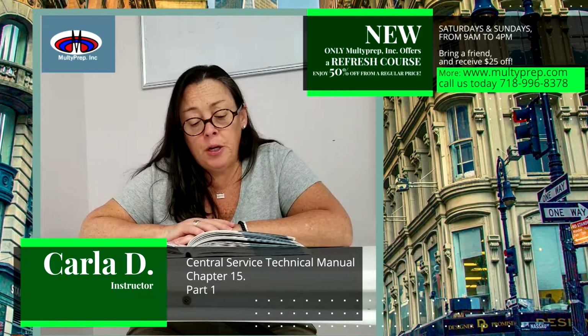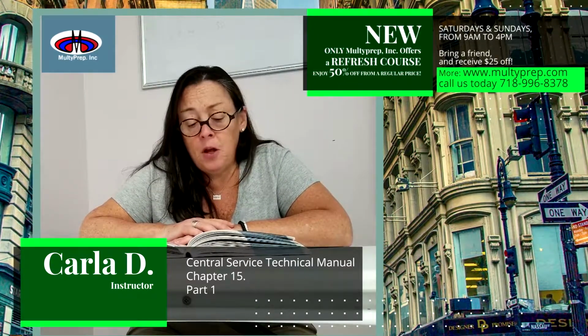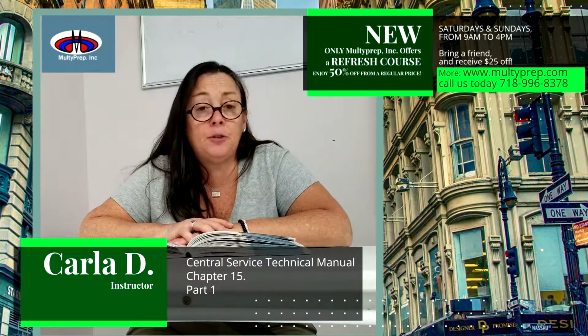Definition: sterility assurance level, SAL. The probability of a viable microorganism being present on a product unit after sterilization.